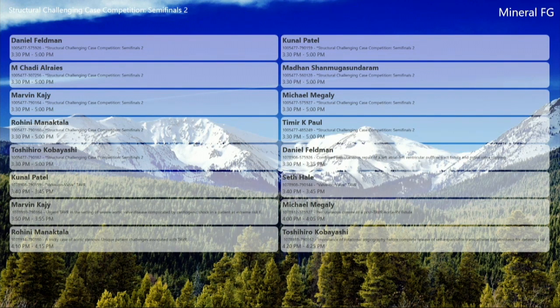I also want to mention the logistics of allowing severe paravalvular leak through the infolding channel while you are removing your delivery system, recapturing it, taking it out of the body, then bringing a balloon to post-dilate it, assuming you're going with a post-dilating strategy. You have to rapid pace the patient to temporize the AI, and then you're trying to balloon and hoping that the valve will expand.